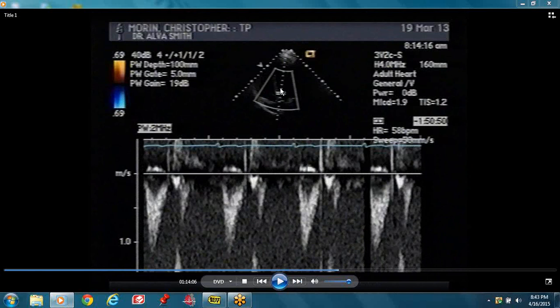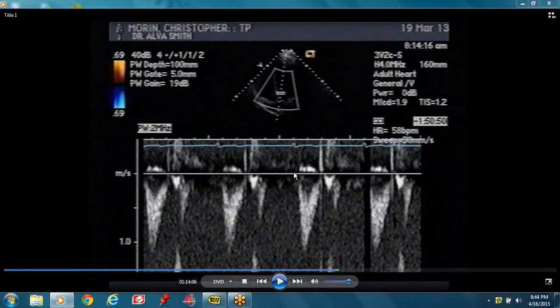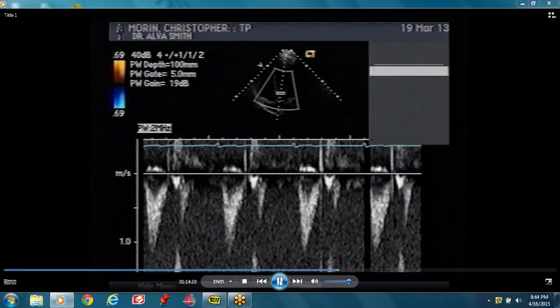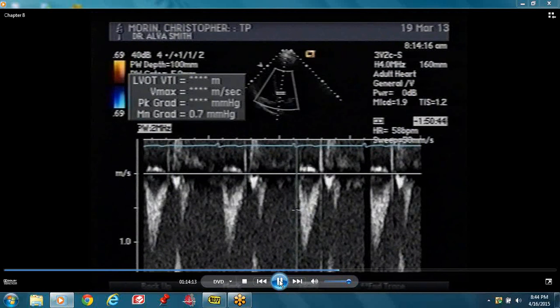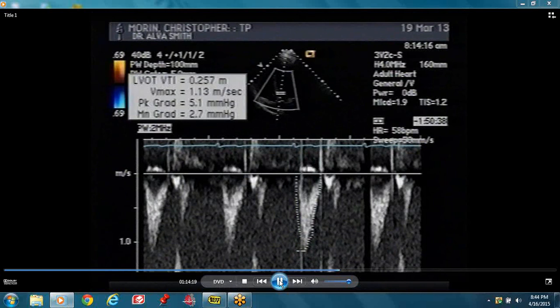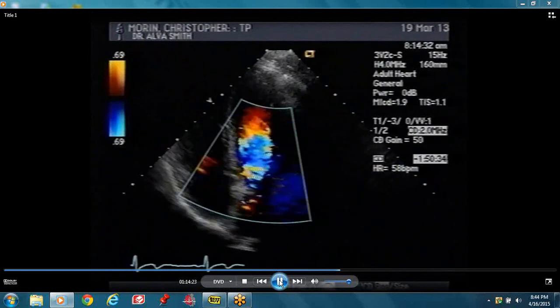Blood flows from the left ventricular outflow track through the aortic valve into the aorta. The transducer is up there and the blood is moving away from the transducer, so it's below the baseline. To get your LVOT VTI, you just plane this — it's a systolic flow, so you plane it and trace it. The computer will give you everything else.